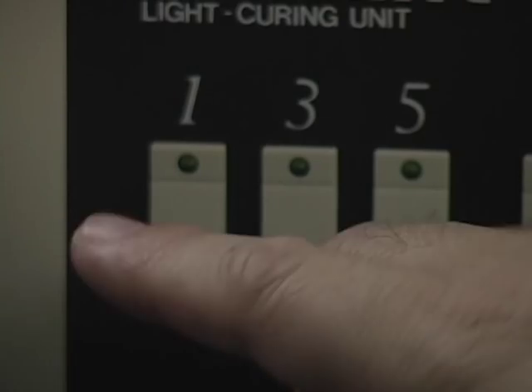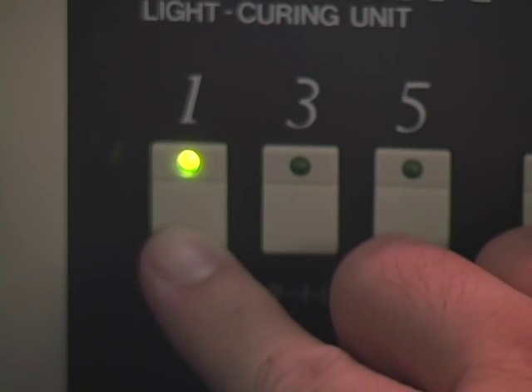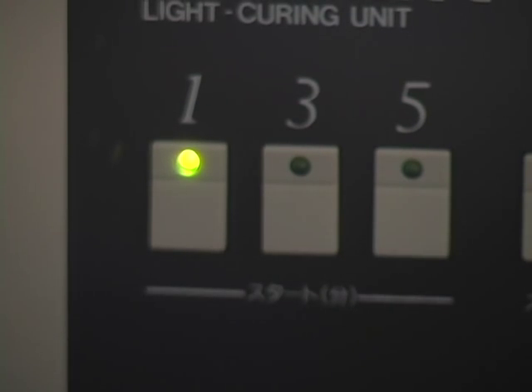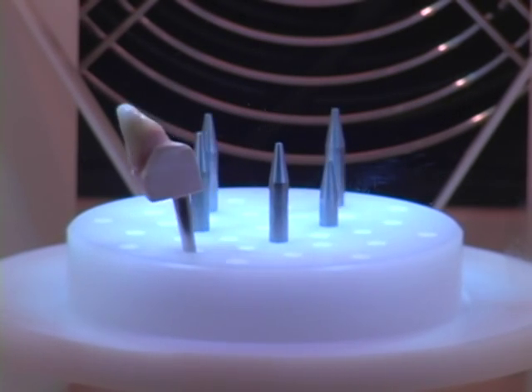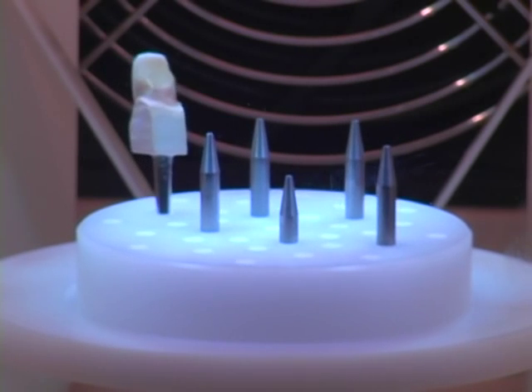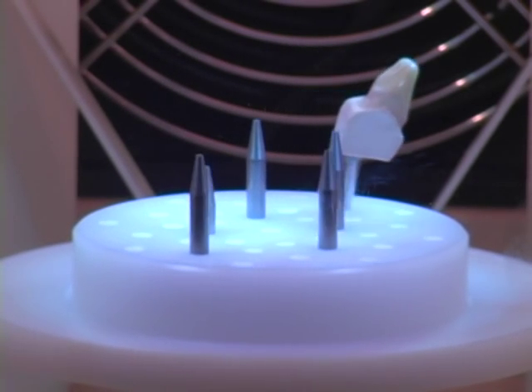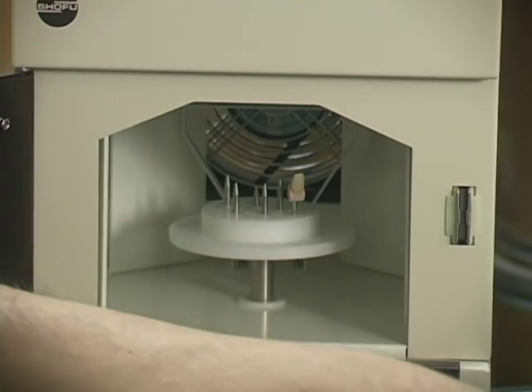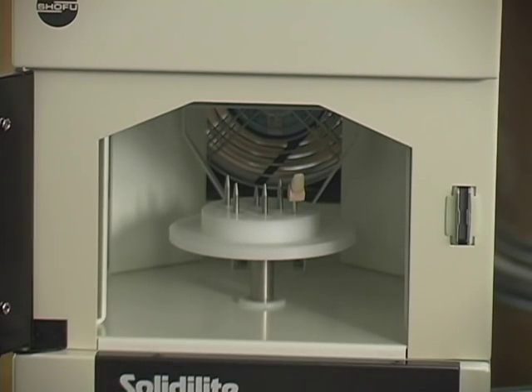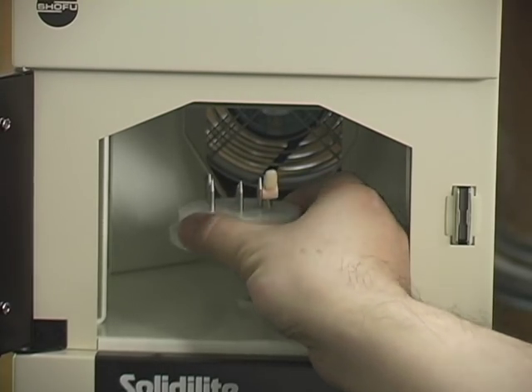Place the die on the tray and select button number 1 on the curing unit to light cure for 1 minute.